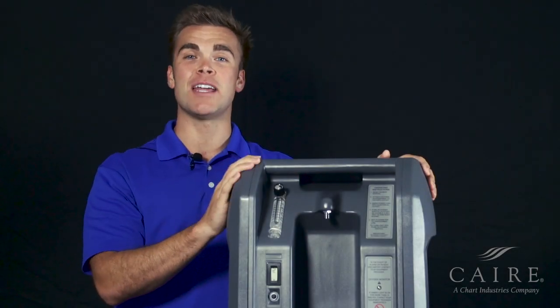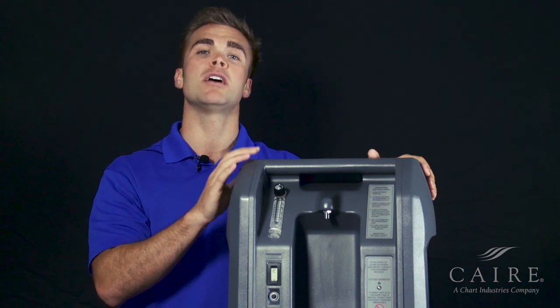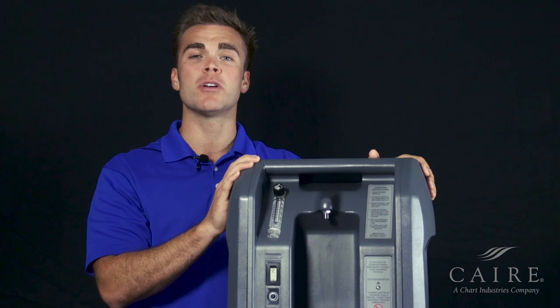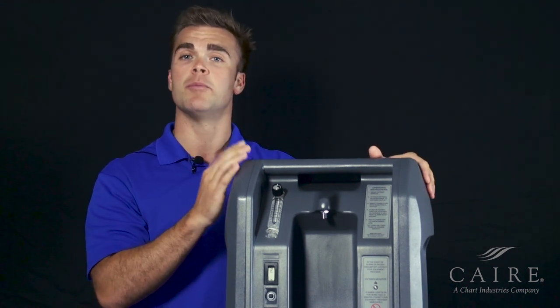Hey, thanks for joining me today. My name is Andy Jessup, and I'm going to be going over the basic operation for the New Life Intensity Unit. First thing we're going to do is talk about the different controls on the unit and then how to actually hook up the unit.